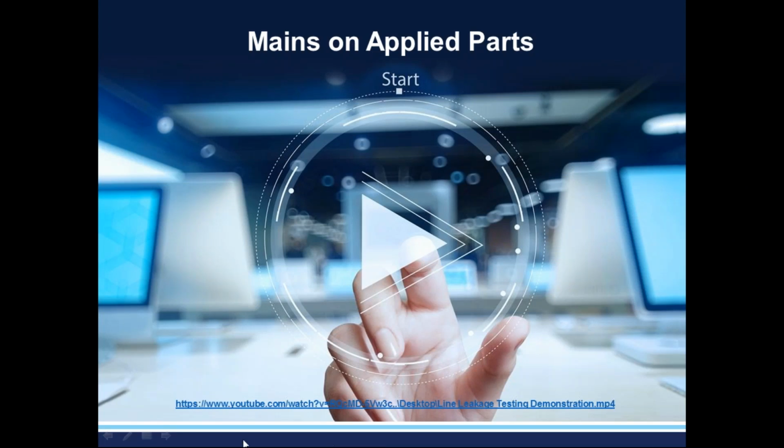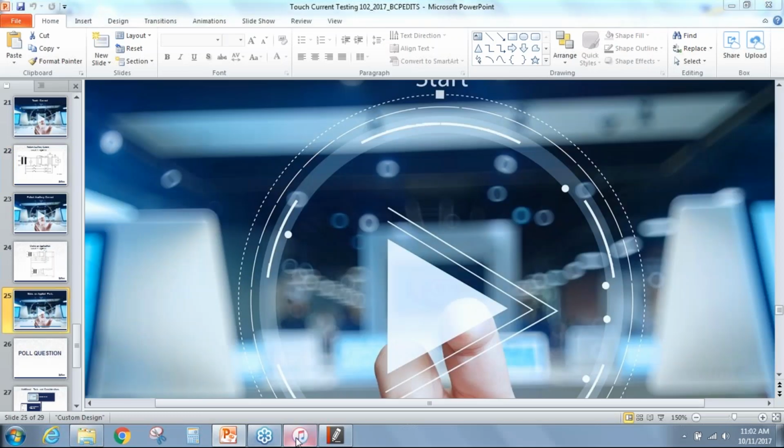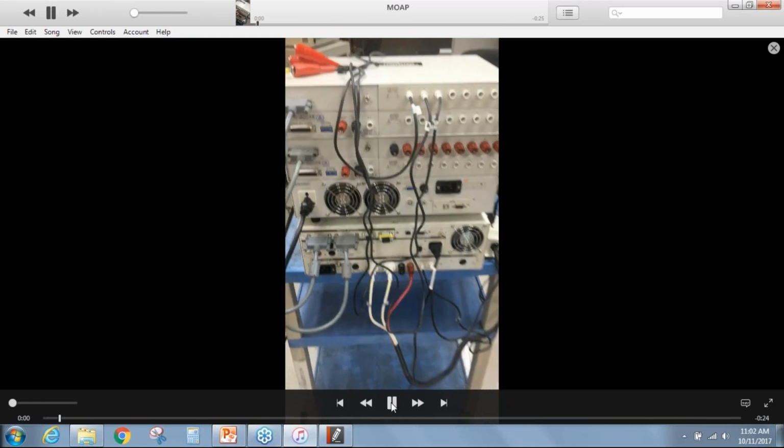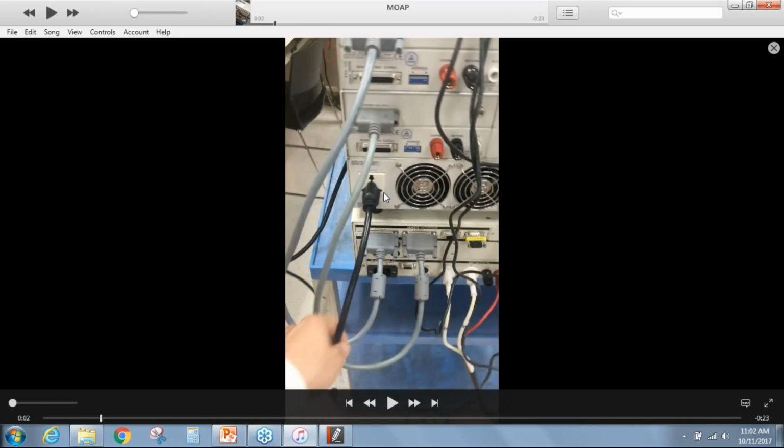And the video for that is kind of just a little complex video, but I'm going to show you how. I'm going to pause it for a second. So we have a transformer T2. We use an isolation transformer sold by our sister company, APT Power Supply, that provides an isolation transformer for all-in-one systems, where we're going to take an output.